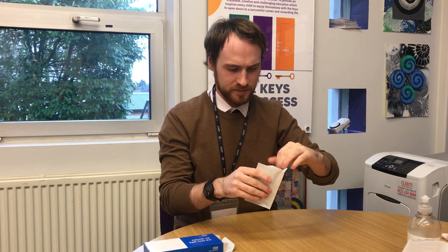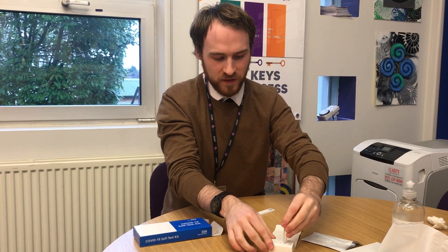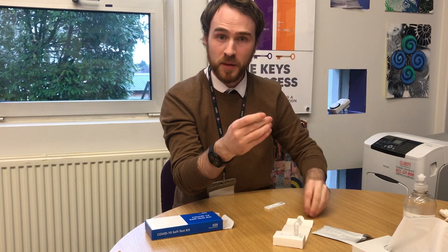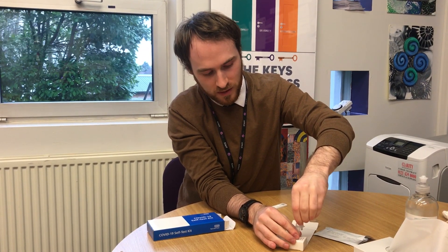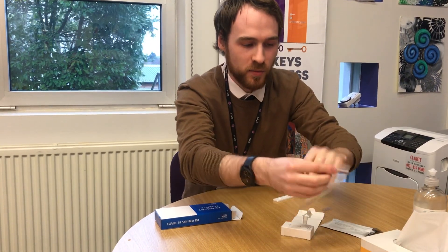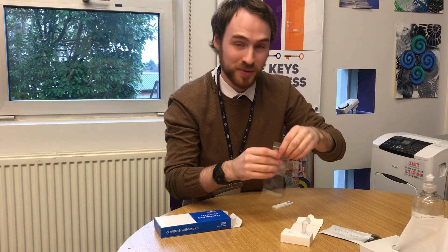Next, open the bag and pull out the lateral flow test. It's also worth blowing your nose before you go about doing this. Once you've got the test, grab the vial and place it in the small holder there for your convenience. Take the extraction fluid, gently twist the top off, and squeeze that into the vial. As we go along and produce some wastage, you can take one of these small bags and pop that inside to be disposed of in your general waste when we're completely done with the procedure.